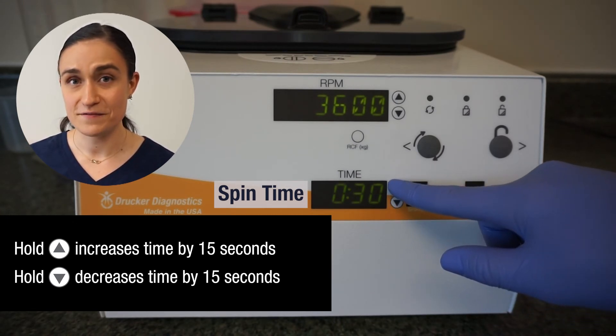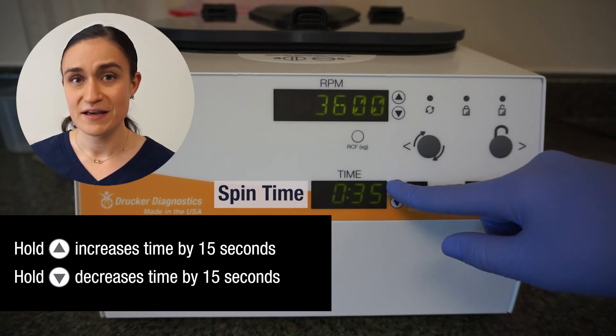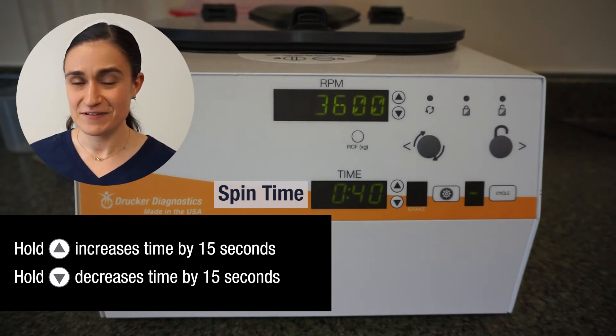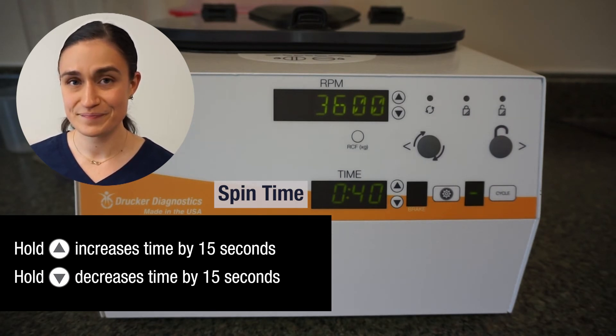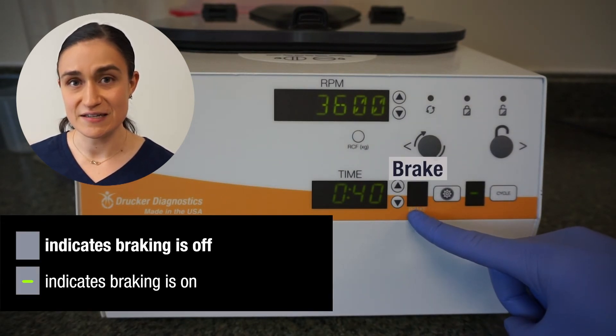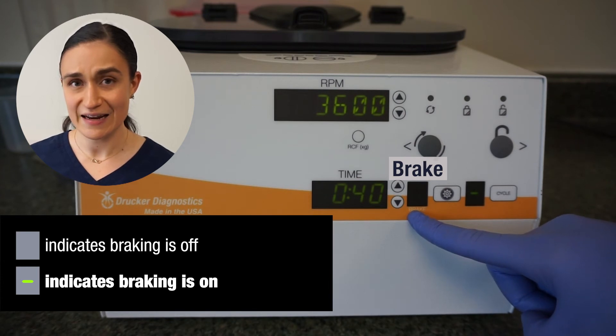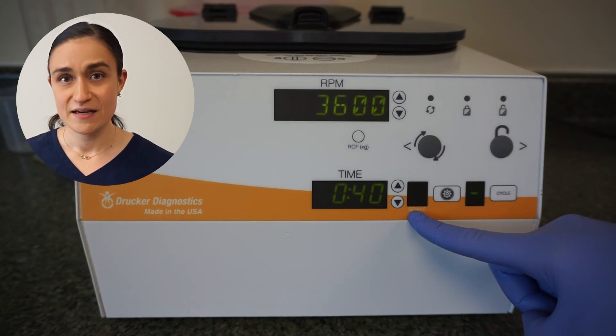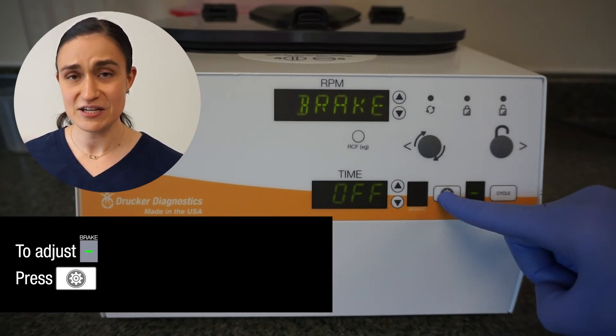Keep in mind, as with the RPMs, if you overshoot your target time, you can always use the down arrow to decrease. And likewise, if you decrease too much, you can use the up arrow to increase again. Next to that, we have a brake setting indicator. If the screen is dark, that indicates the brake will not engage to slow the rotor at the end of the cycle. If there is a line in that screen, that indicates that the brake will engage to help slow down the rotor. To adjust the brake setting, hit the menu button.